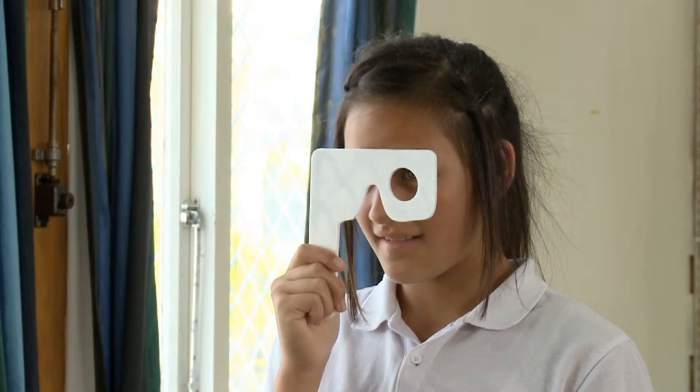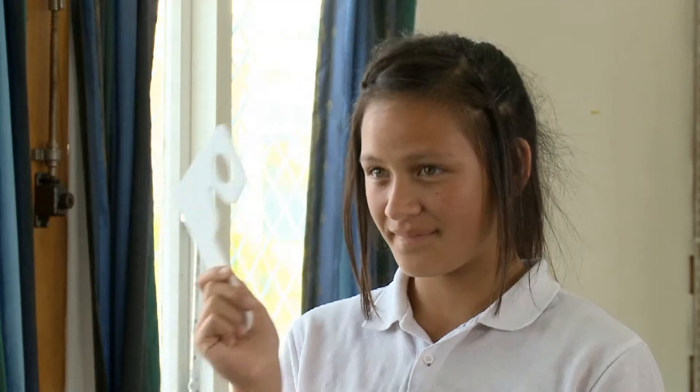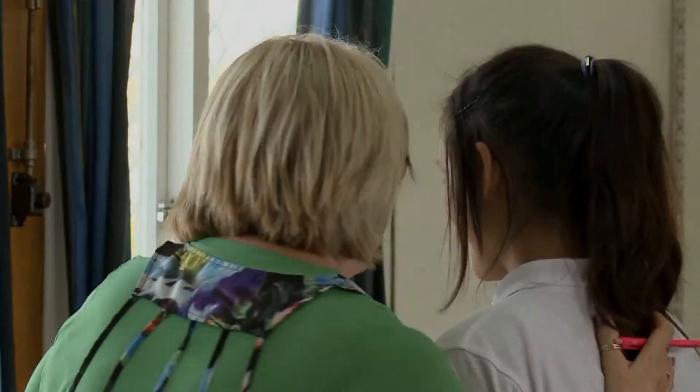Two beautiful eyes you've brought for me to test today. Well done honey. That's a pass. Good job. Thank you. All done. You passed. Well done.